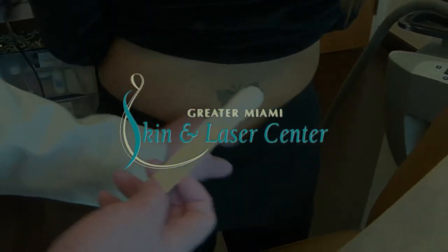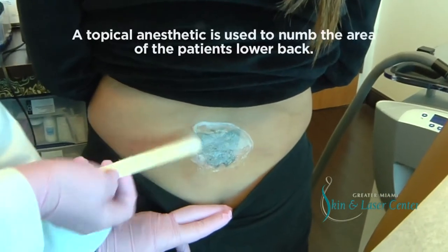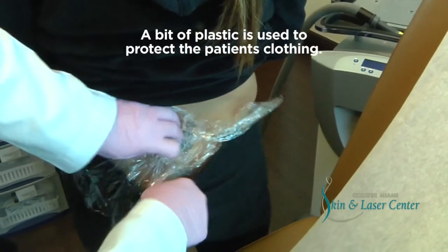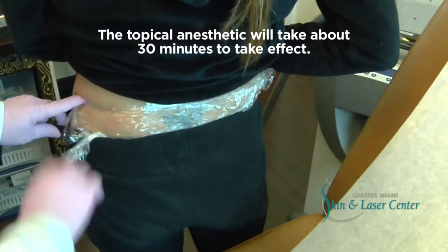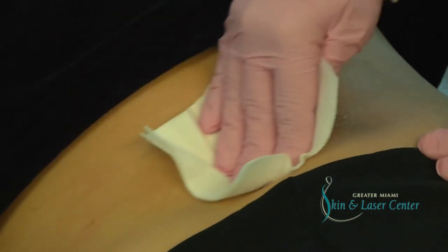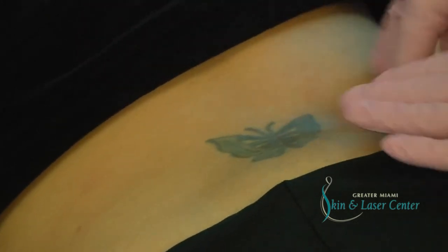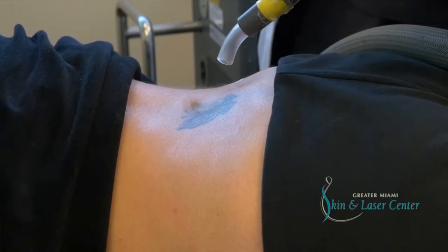Get the area a little bit numb and make it more comfortable. Let me secure it with a little bit of tape. It's been 30 minutes now and we're going to remove the lidocaine. This is going to make the treatment more comfortable along with the Zimmer, which we use to blow cold air and soothe a little bit of the heat from the laser.